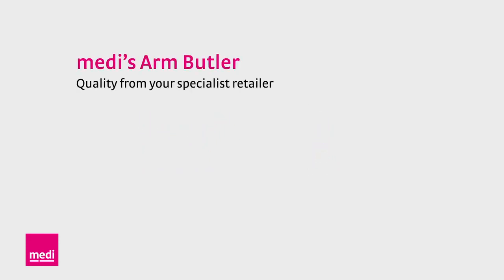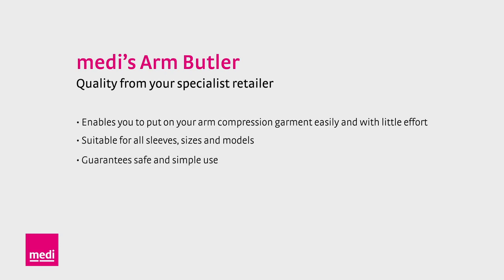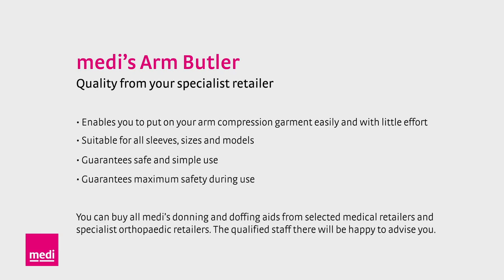Midi Butlers are very simple to care for — you can wash them with standard cleaning agents and disinfectants. The Midi Arm Butler enables you to put on your compression garments easily and with little effort. It is suitable for all arm sleeve lengths, sizes and models and guarantees safe and simple handling. Putting arm sleeves on with the butler is very easy when you know how, and it helps you to start the day with your compression arm sleeves.